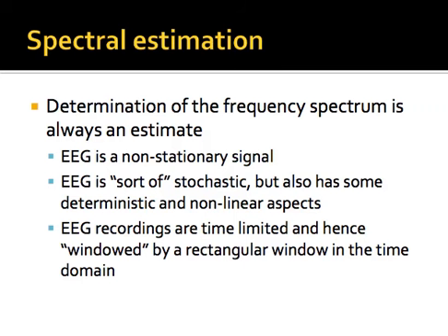So often, to get around this problem, before the Fourier transform is taken, before anything is done in the frequency domain, the EEG recording will be multiplied by a different kind of window, something like a Chebyshev window or a Hamming window or some window of a different shape that is less likely to superimpose a drastically different frequency characteristic on your data.